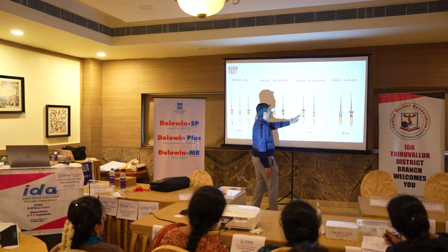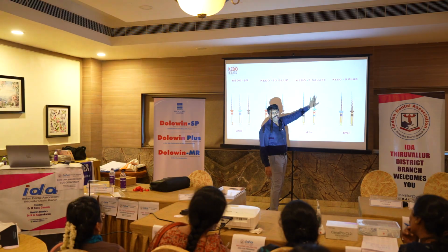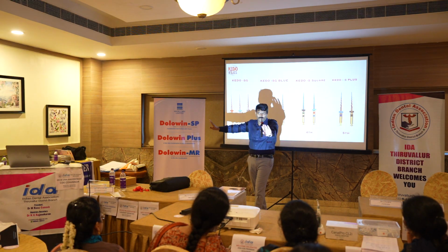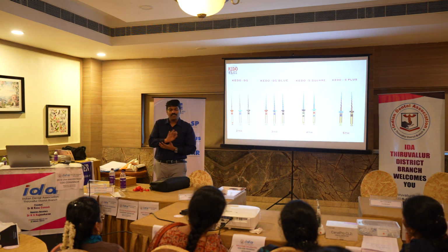I have bypassed the tip diameters of 25, 30, 35 and I have kept this particular diameter as 0.28 and 0.38 and I have manufactured one particular file. According to endodontists, they will not accept because you have to follow the ISO standardization. I am not worried about it. Right or wrong? If it is right, why?